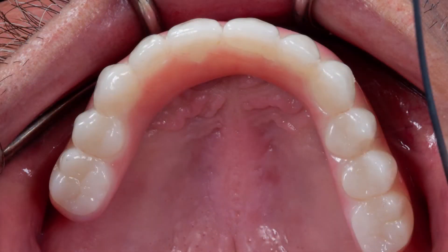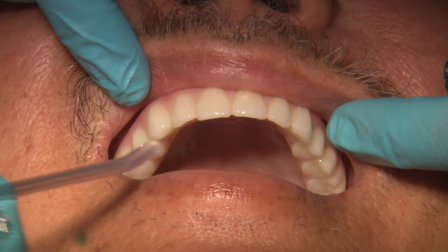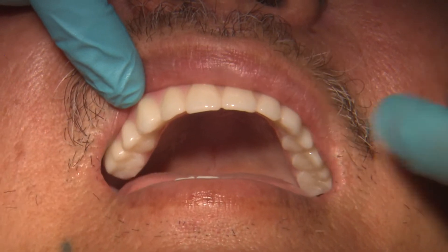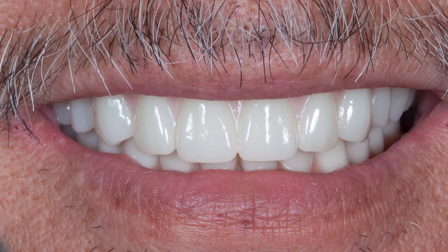Once the Bruxer prosthesis is fully seated, let's quickly run through our checklist one last time. Confirm the midline and incisal edge position, evaluate the patient's smile, look at the lip support, the contour of the smile line, and the pink-to-white ratio.